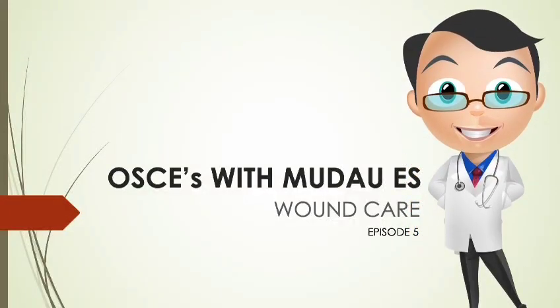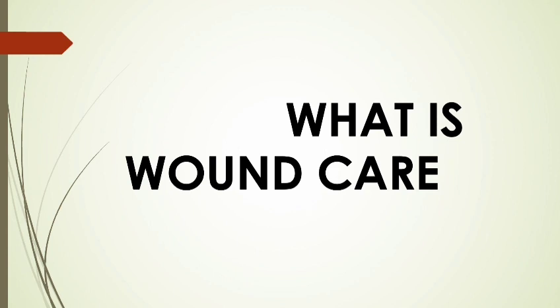Today we will be focusing on wound care procedure. Wound care is the procedure that includes cleaning, disinfection, and protection of the wound while respecting the rules of hygiene. It is also done to promote healing.